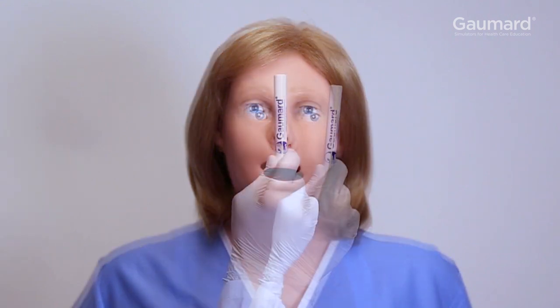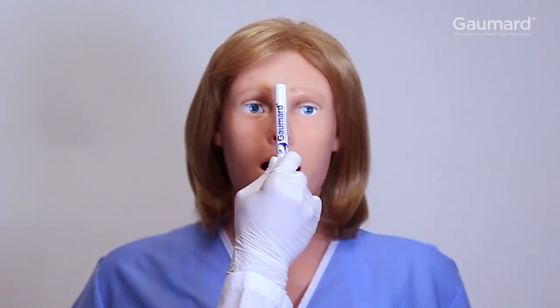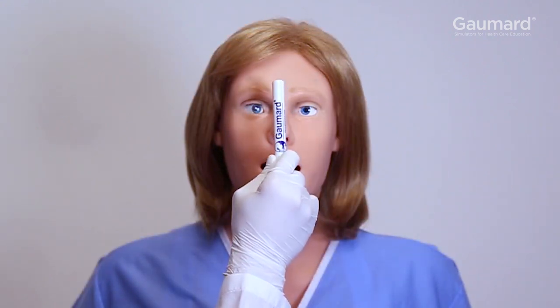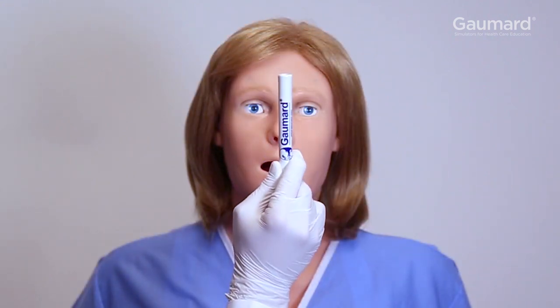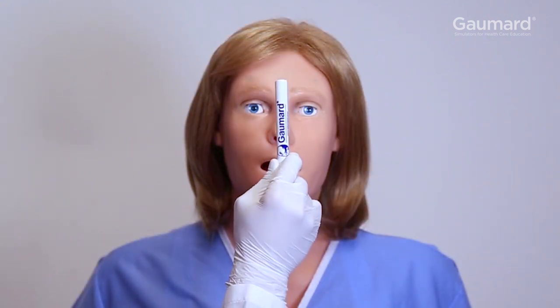Moving the pen or finger between the eyes and close to the face will cause Victoria to cross her eyes.